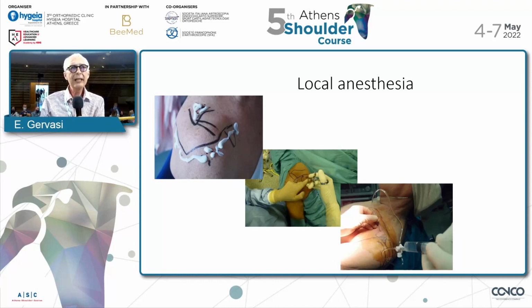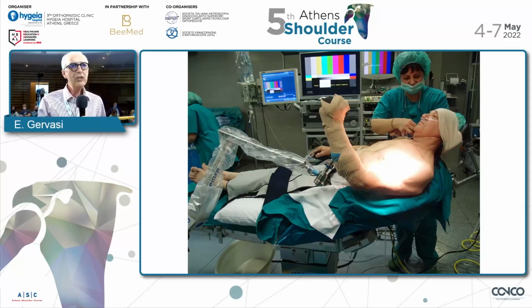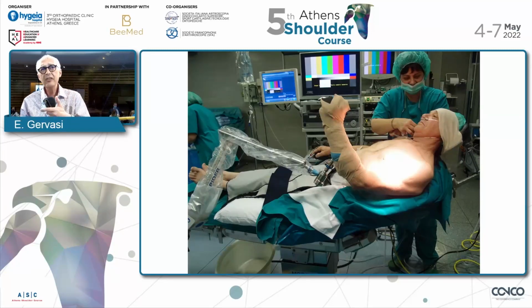In local anesthesia, the anesthesia of the suprascapular nerve, and then I move to just a volume, so water and local anesthetic into the subacromial space. You have a patient ready for the implantation. You can use both the beach chair position or the lateral position. The lateral position is safer because if the patient has regurgitation, you are in a safe position.